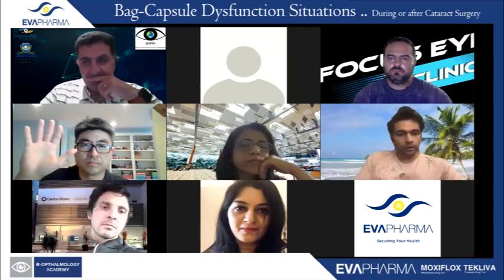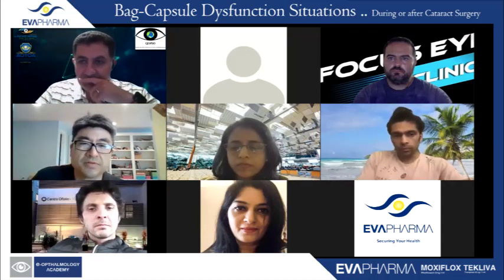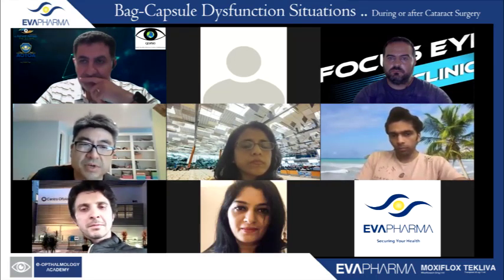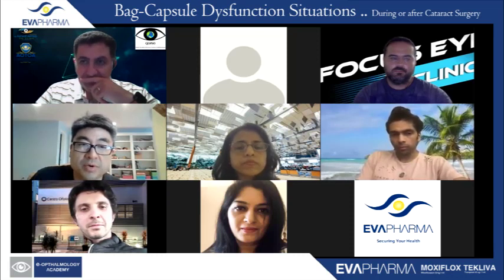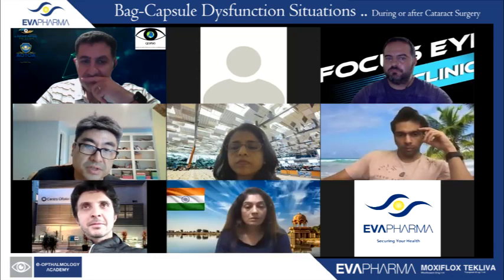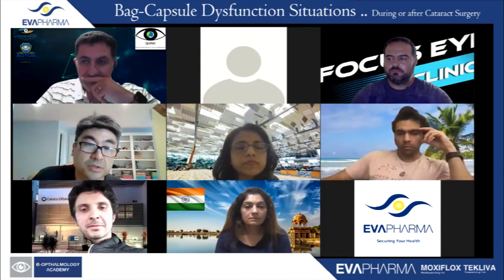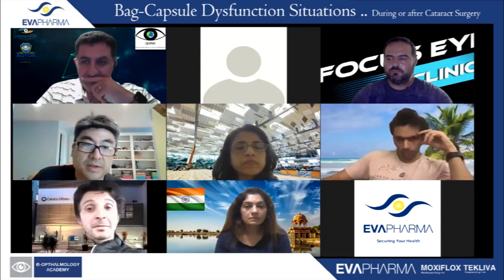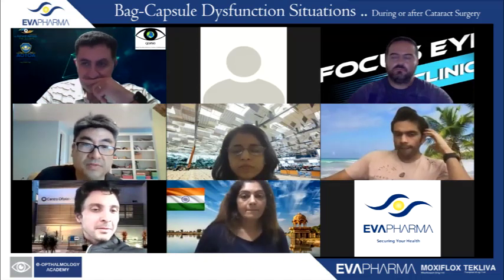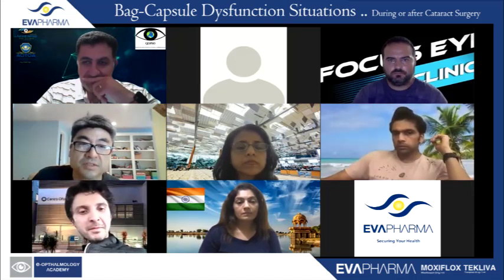So from the panel, Brian, please go ahead. I think it's a great tool because, for the person who's intimidated to deal with the vitreous, if you have an unstable bag situation, you have zonulopathy, and you want to provide a long-term, more stable situation, rather than doing a CTR, a sutured CTS, and all these things, you could transition to a glued IOL technique, not have vitreous, have an intact hyaloid face, hopefully, and learn to build up your confidence in the process of doing the glued.